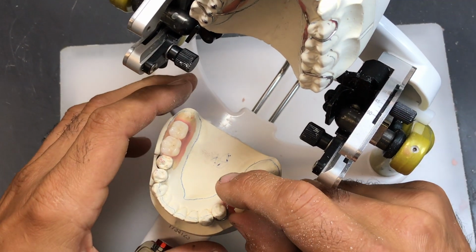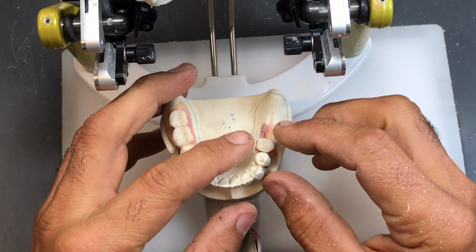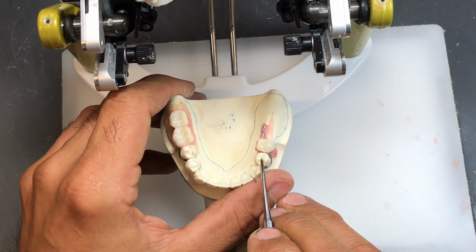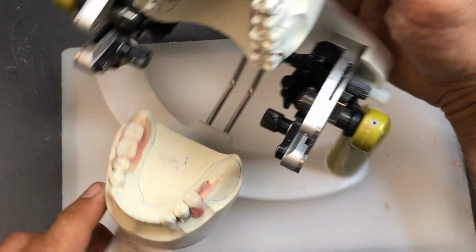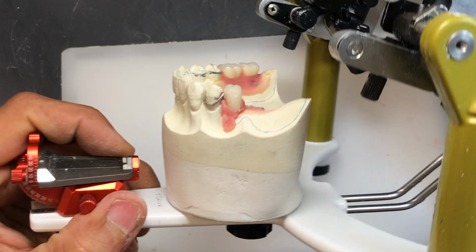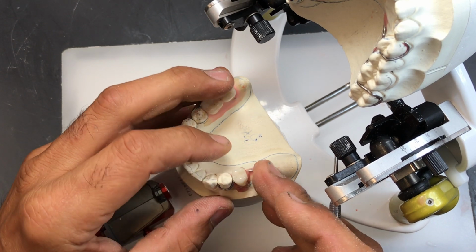Sorry, just trying to get the camera angle correct. So it looks like the central fossa is lining up with 3-4, marginal ridges lining up, buccal ridges lining up, buccal cusp ridges lining up. Looks like the long axis is somewhat correct, but let's see. Let me just change that a little bit. So there's a lot of good things that have to come together.